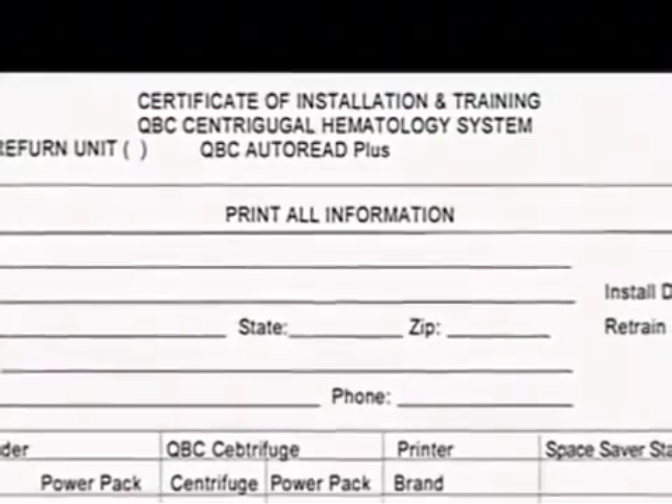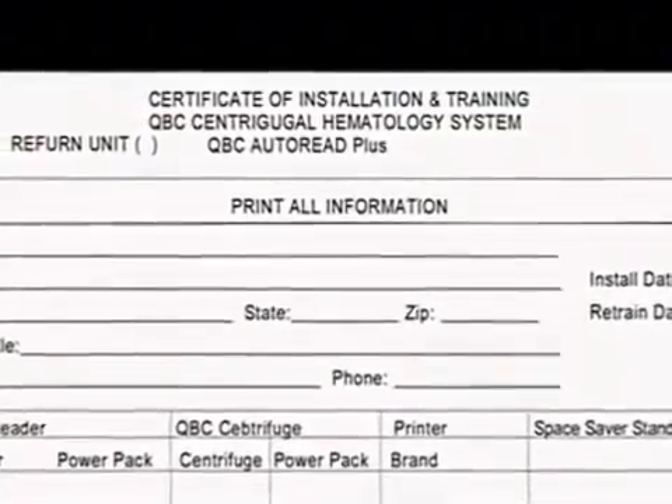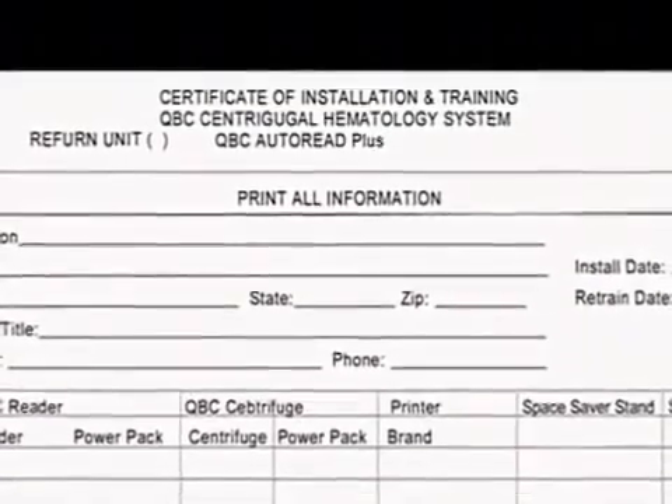Locate the installation certificate which is packaged with the system. It is important to fill this out and return this form. This certificate ensures the warranty of the QBC Autoread Plus system.